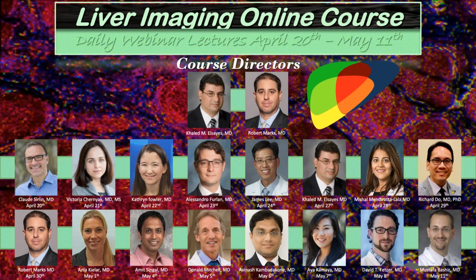And so as Don was saying, you'd want to go through all the images. If after going through all the images, and this is something that Don said during his lecture, so I'm simply repeating what he said, but it's an important point, you're worried that there's tumor in vein but you're not sure, then don't call it an LR-TIV.